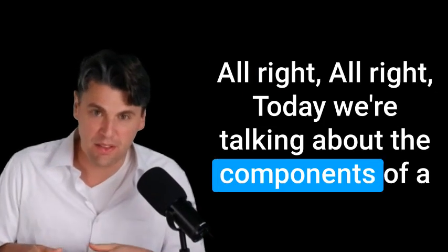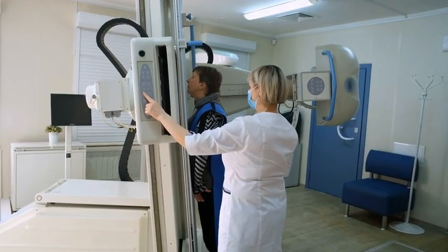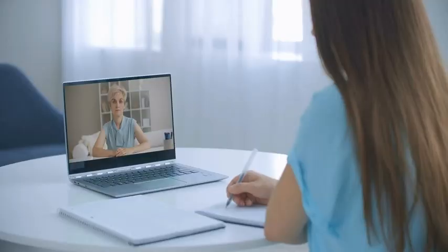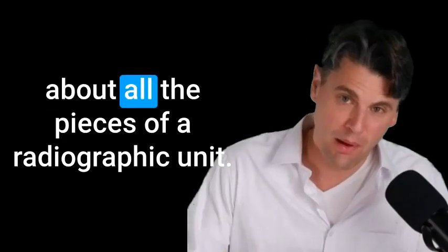All right. Today we're talking about the components of a radiographic unit here at How Radiology Works. This is going to be a complete tutorial about all the pieces of a radiographic unit coming up.